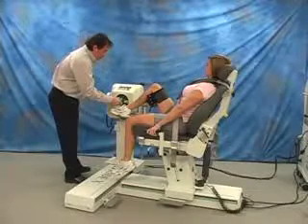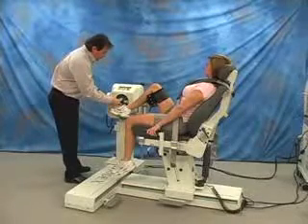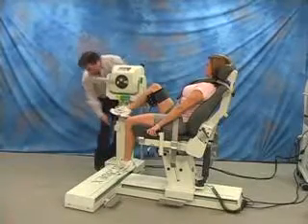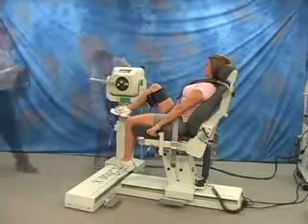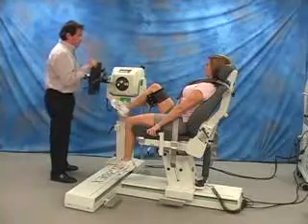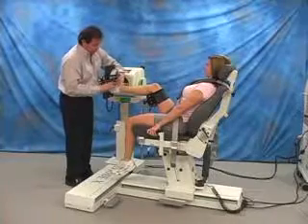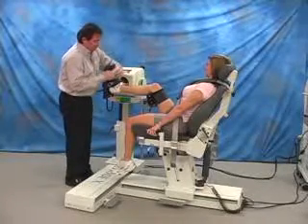With the engraved letters pointing outward, place the input tube on the shaft and elevate the dynamometer. Secure the footplate to the input tube. Strap the foot into the fixture and set the range of motion stops.